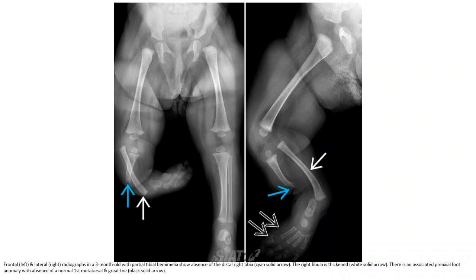Frontal and lateral radiograph in a 3-month-old with partial tibial hemimelia showing absence of the distal right tibia; the right fibula is thickened. There is an associated preaxial foot anomaly with absence of the normal first metatarsal and great toe.